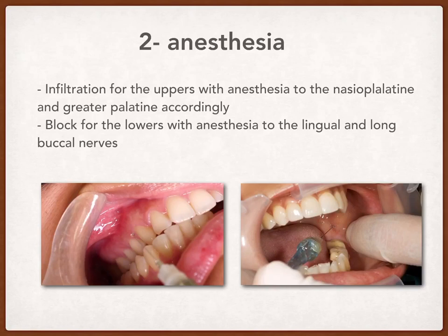If there are no premolars and that is an elderly patient, you should predict the area and the height of the premolars and insert the needle from that direction, as you can see here in the right picture. This is the vertical height of the needle. On the other hand, the horizontal direction of the needle will correspond to the following.